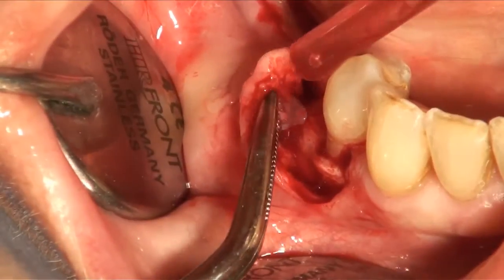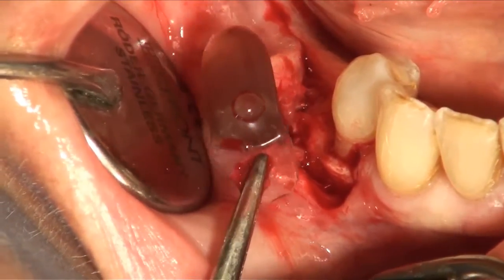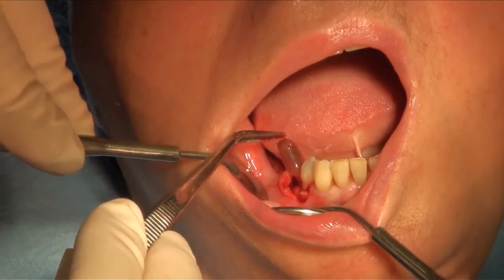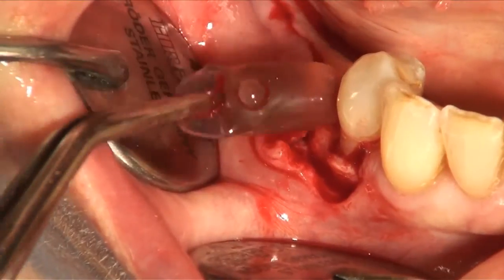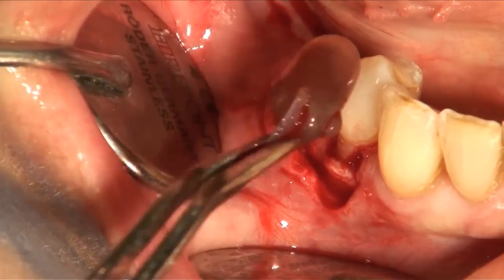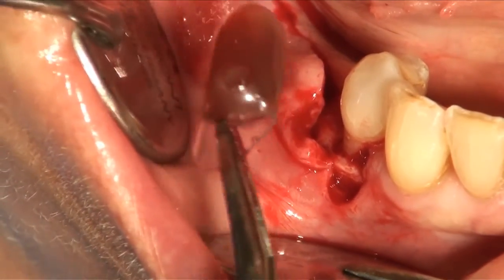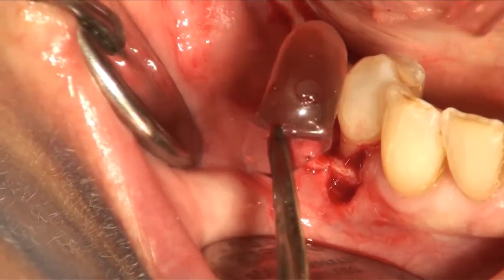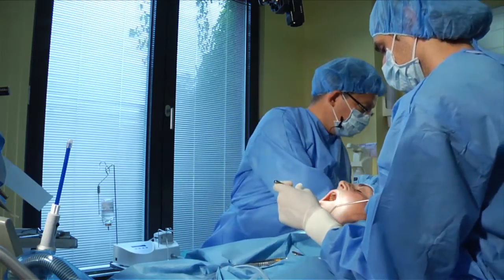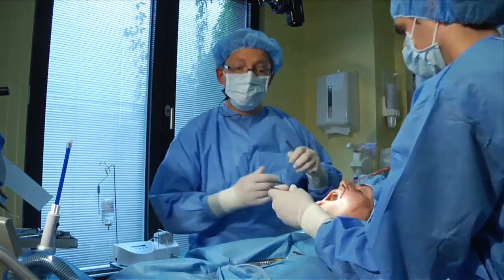It sticks there, quite sticky. And here we go. You see this expander is completely safe, so it is expanded in an optimal way, and still the outer silicone shield is around the capsule, so the function of this expander was ideal. Now we go ahead and prepare the flap.